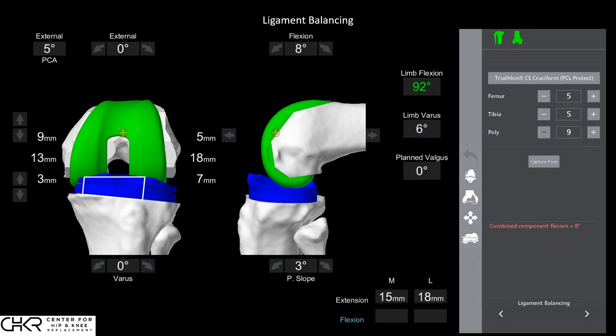The next phase occurs dynamically during surgery. We begin to characterize the patient-specific ligament deformity and extent of contractures. Having already established anatomic placement, we now look at patient-specific deformity. At 90 to 92 degrees of flexion, this patient has six degrees of varus, and most importantly has an asymmetry or imbalance of the flexion gap — the medial side is five millimeters more contracted than the lateral side. This is a very asymmetric, unstable flexion gap, and we will begin making small adjustments within the limitations of the anatomy to correct this asymmetry.